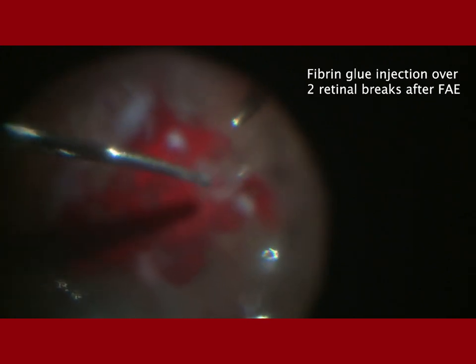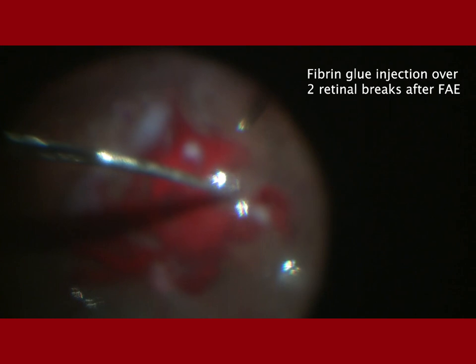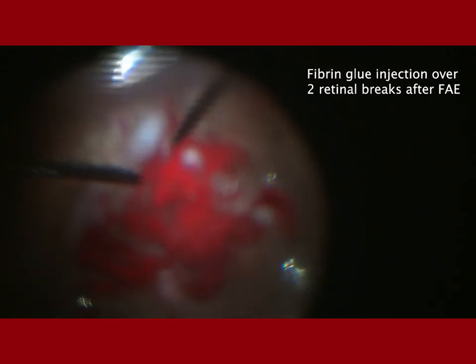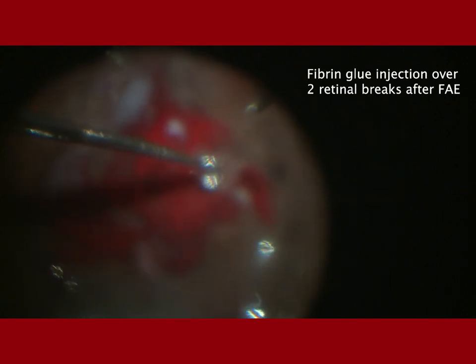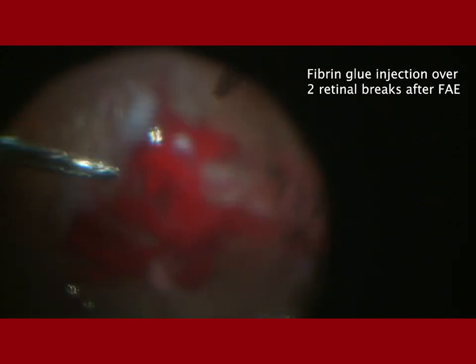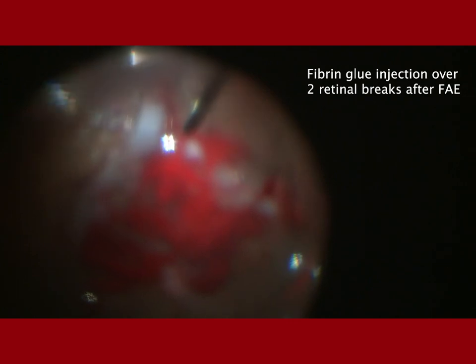This is another patient with PDR combined RD, where two breaks not adequately treated with laser due to edema and hemorrhage were closed by injecting the two components of the fibrin glue sequentially over the two breaks.